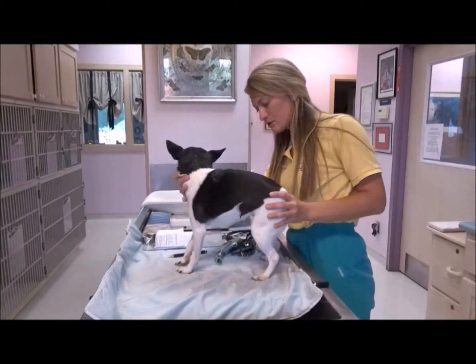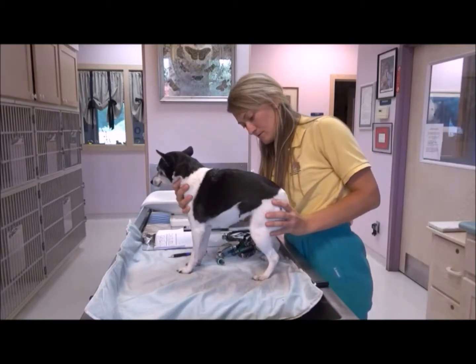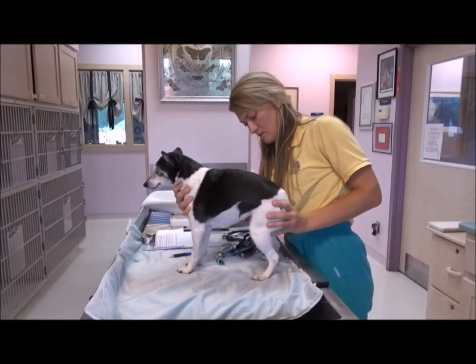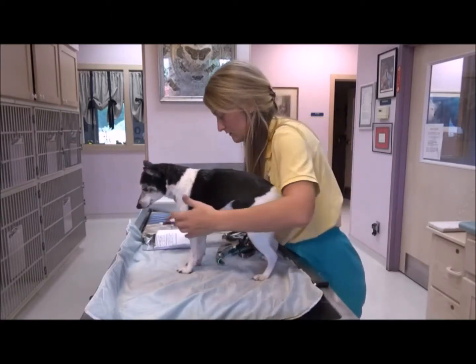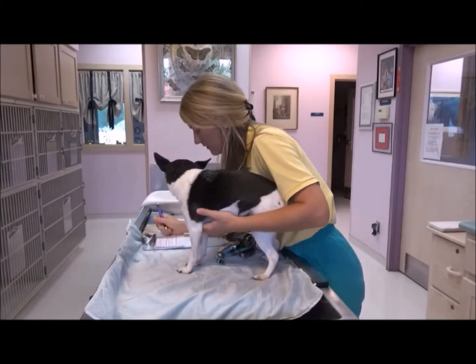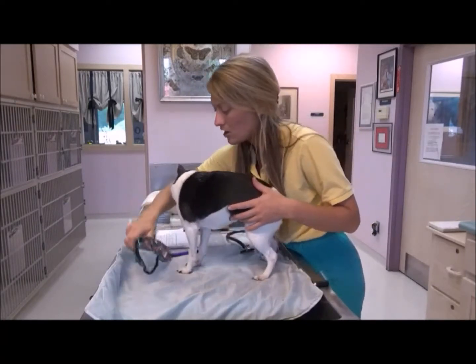We'll check her respirations. I have a stopwatch over here helping me out. Okay, and that would be 24, so that's good. Next, I will listen to her heart.